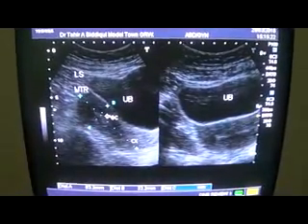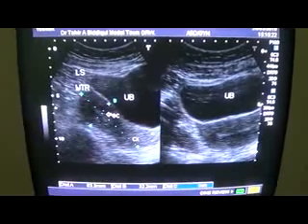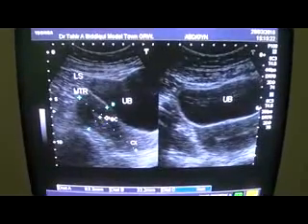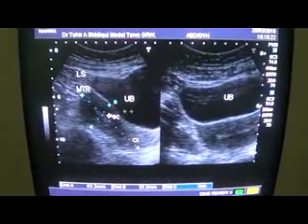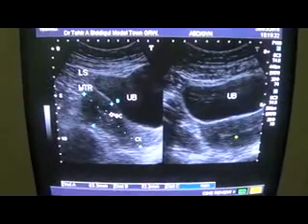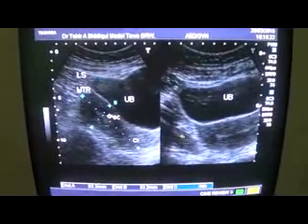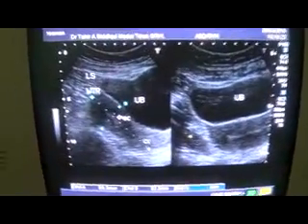So I'll go for a subseptate uterus with two endometrial canals, and when we scan in longitudinal section, you will note that the cervix is 1, vagina is 1, body is 1, but then there is diversion of the endometrial canal into 2. With no indentation in between, this is a case of subseptate uterus and type 5 Mullerian duct anomaly that we say. And this is the right ovary, with no follicular activity in the right ovary.